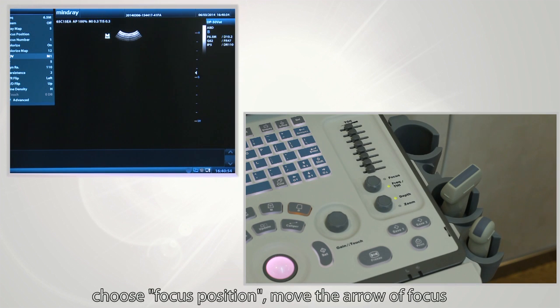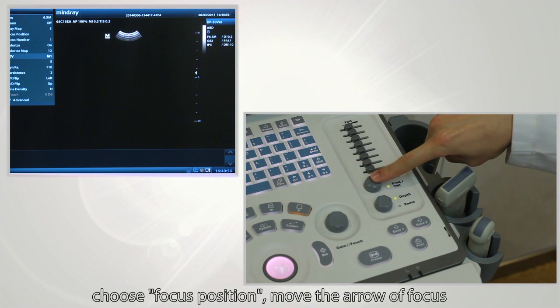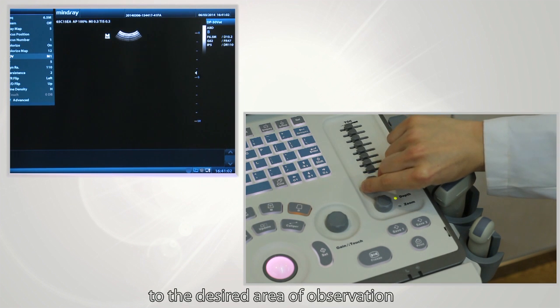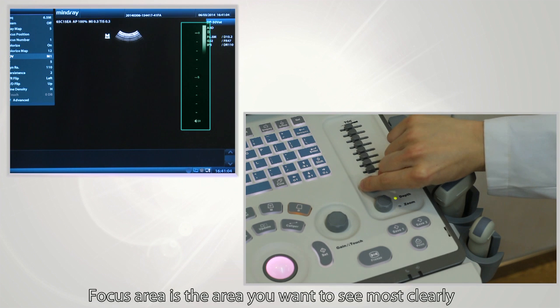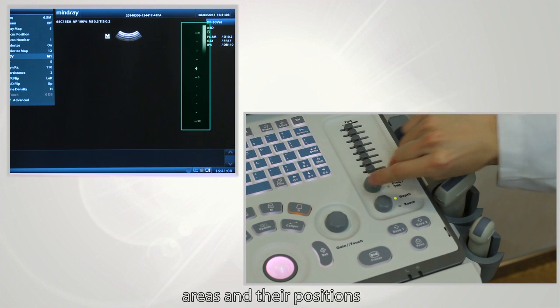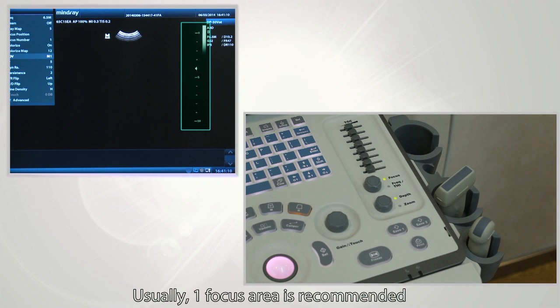Next, adjust focus. Choose the focus position and move the focus arrow to the desired area of observation. The focus area is the area you want to see most clearly. Select the number of focus areas and their positions — usually one focus area is recommended.